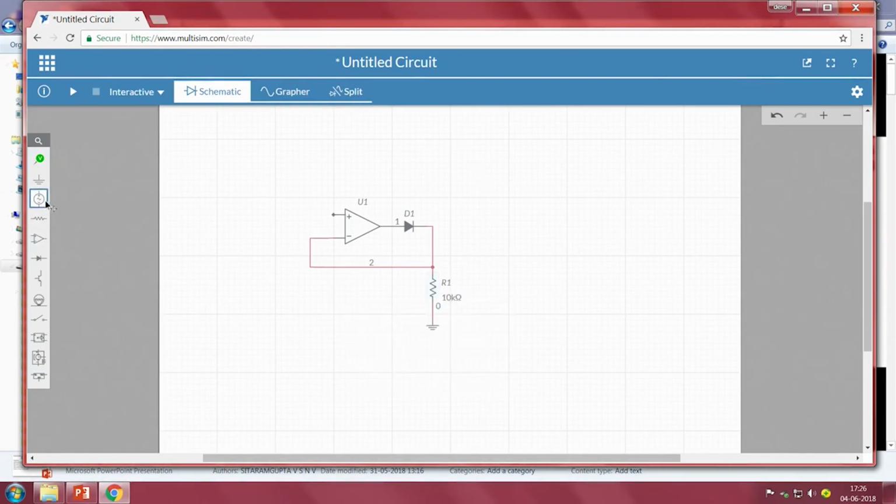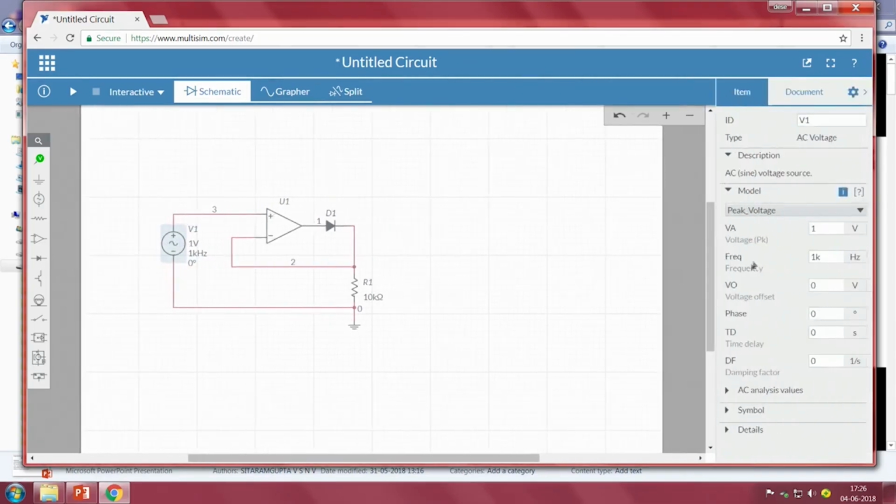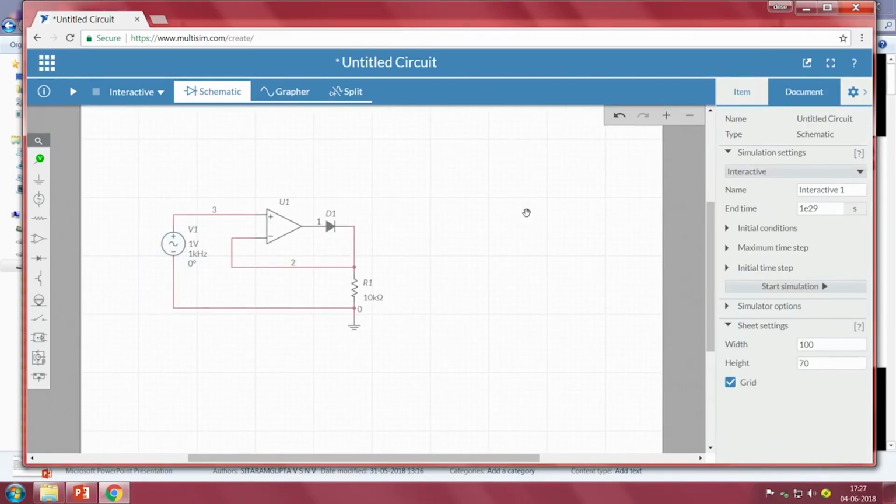Now, to understand the working of the diode, the working of our half wave rectifier, what we do is connect a sinusoidal input signal, and the peak to peak value is 2 volts, because this signal is generally used to represent a peak voltage itself. Since we require the positive peak and negative peak as an input signal, it is easy to understand whether it is passing only the positive peaks or positive as well as negative peaks. So, we can take peak to peak as 2 volts.